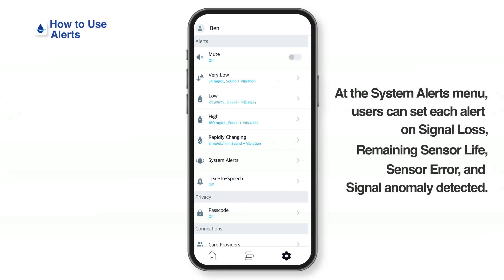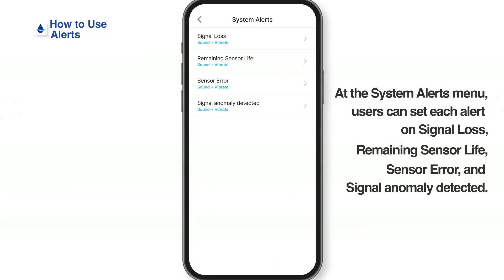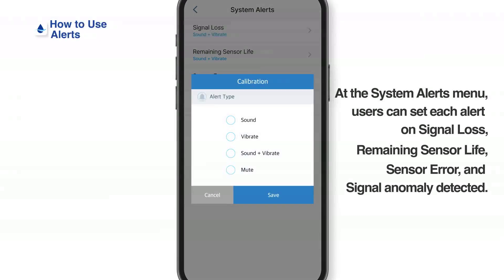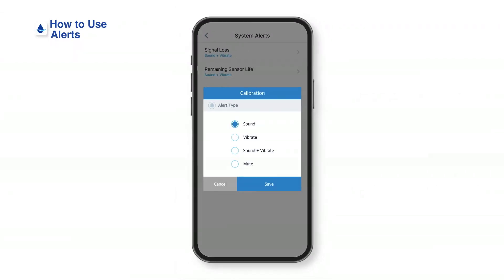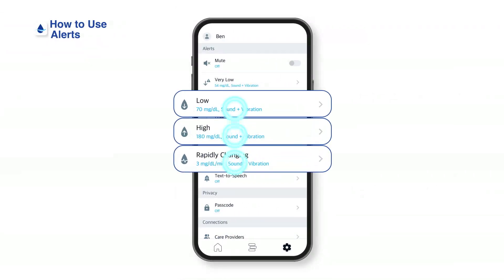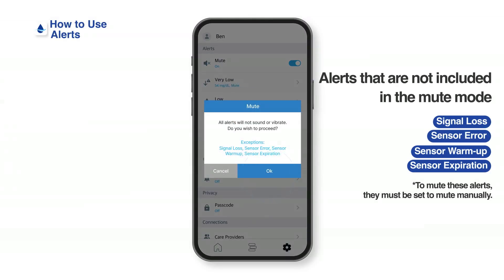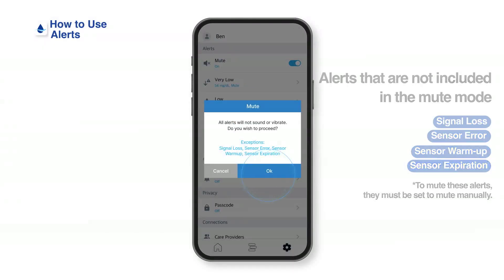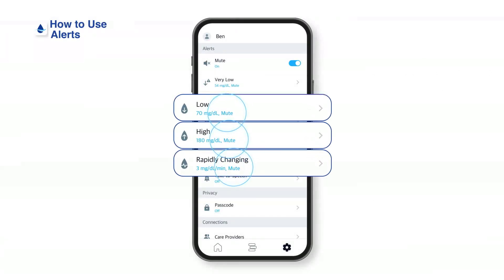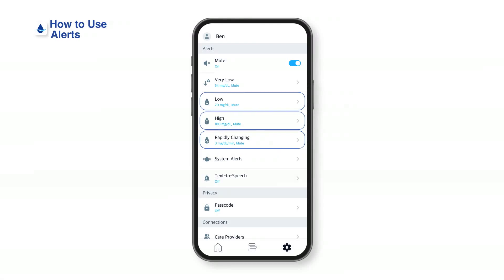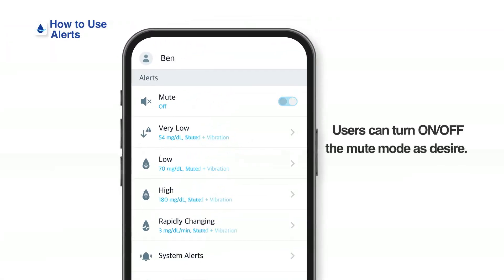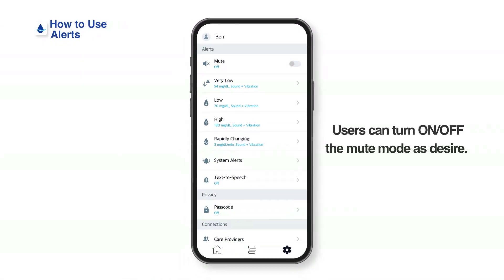System alerts: at the system alerts menu, you can set each alert for signal loss, sensor expiration, error, and abnormal activity. Mute mode: when you enable the mute mode, all alerts are set on mute. You can turn on or off the mute mode as you prefer.